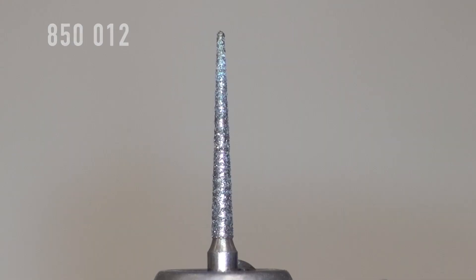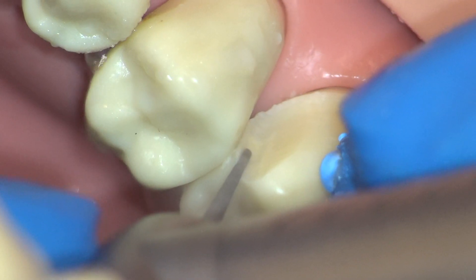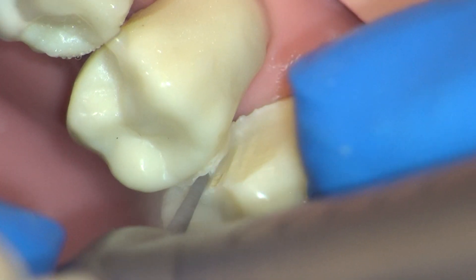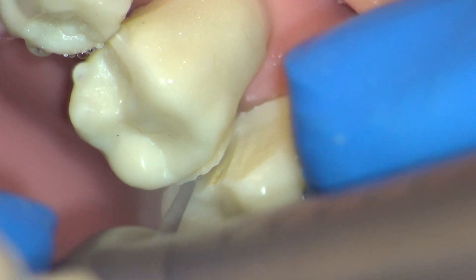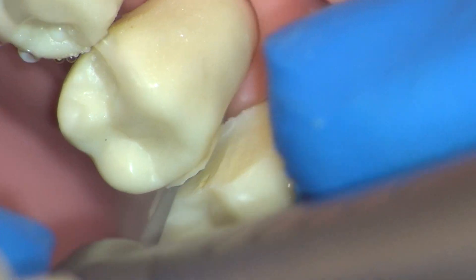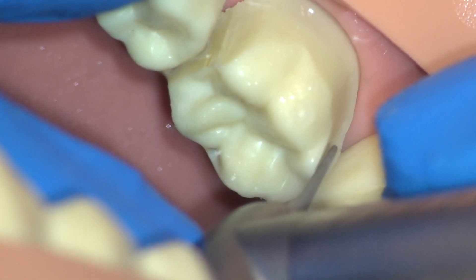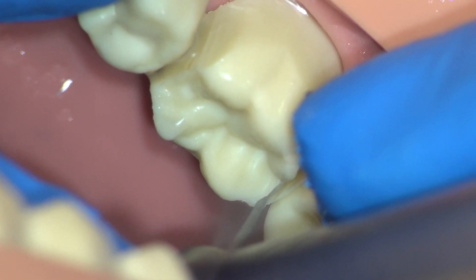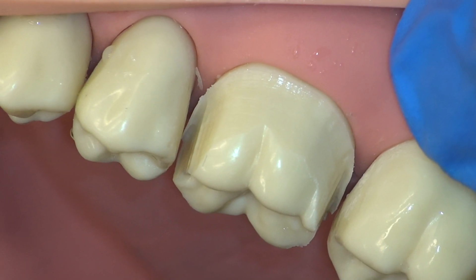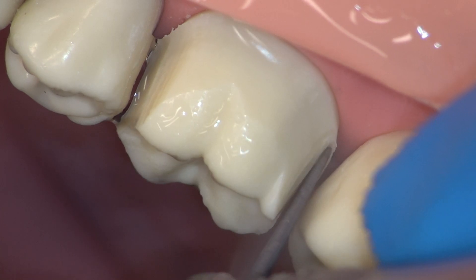The next step is interproximal separation. We begin by using a thin 850 burr to reduce the bulk of tooth structure before moving through with our final burr. This step can be completed with an occlusal view as shown or with a direct buccal view. In this demonstration, this step is completed in multiple passes. Be sure to be patient and methodical. Ensure to follow through with completion of this separation as you approach the lingual side. Flake away the protective enamel shell. Upon evaluation from the direct buccal view, we can see that our interproximal separation needs to be moved gingivally. Complete this as necessary before moving on to the next step.